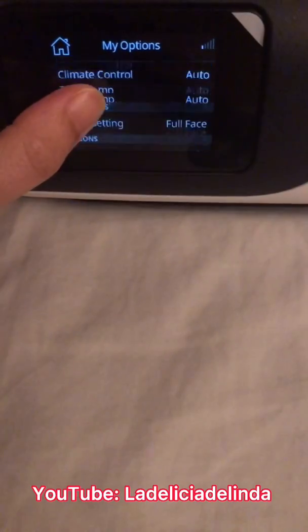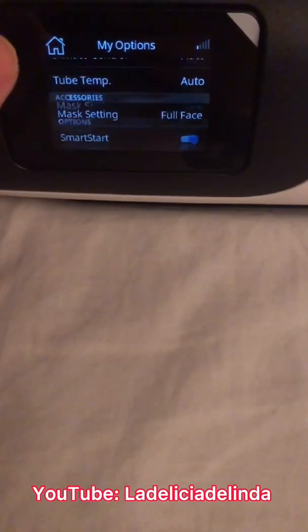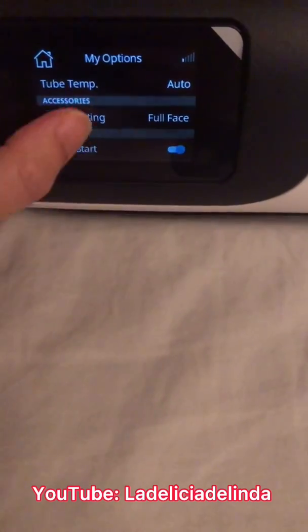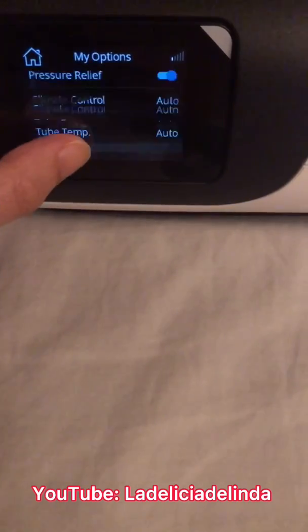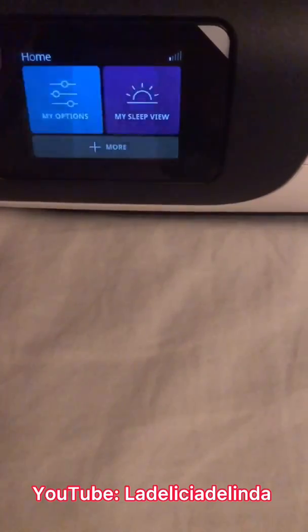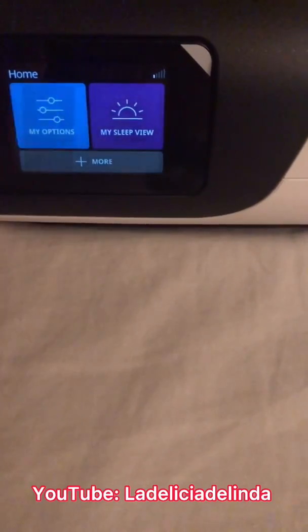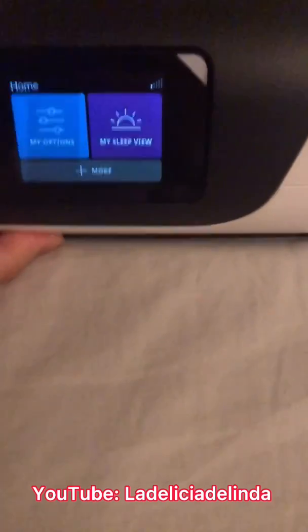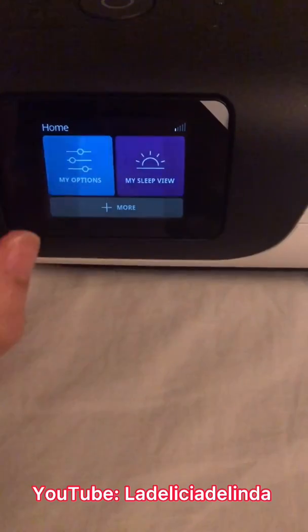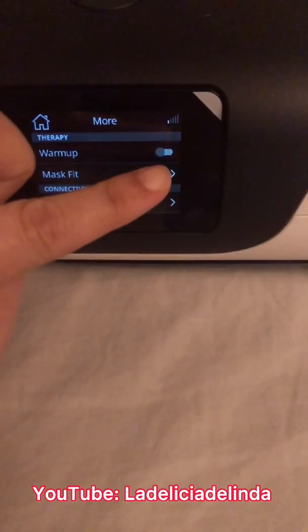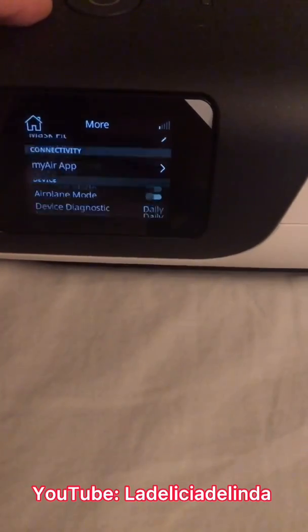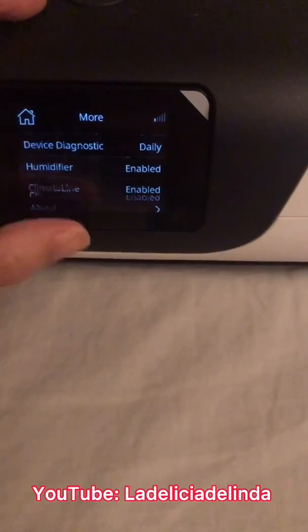If you don't have the heated tubing you won't have access to climate control — it will just have default humidity settings. Under the options you have smart start/stop and smart stop mask settings. You also have 'My Sleep View,' which is a simplified version of the data your respiratory therapist usually gets. There's also a warm-up feature, which I highly recommend if you use the humidifier — it warms up your humidifier tank.